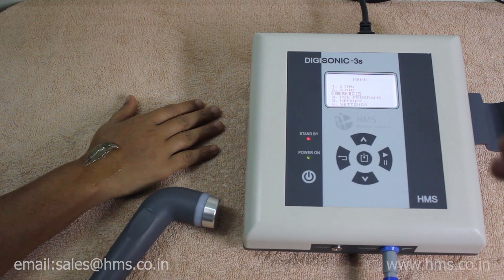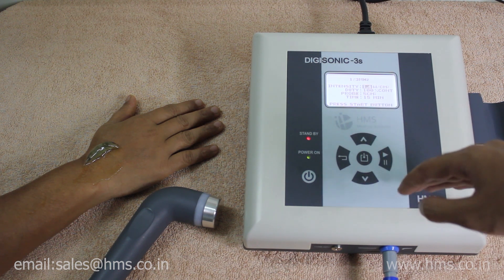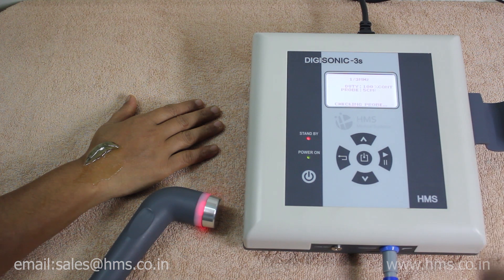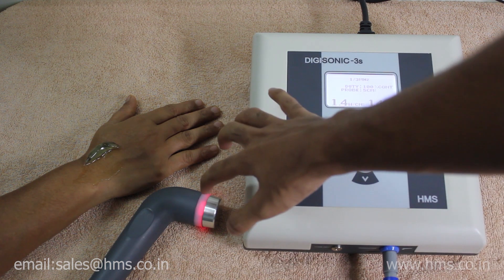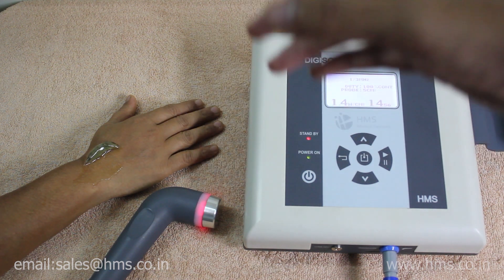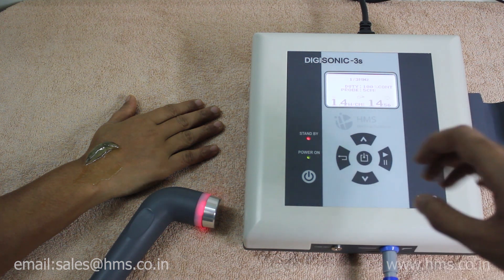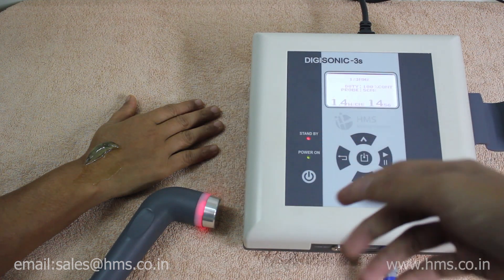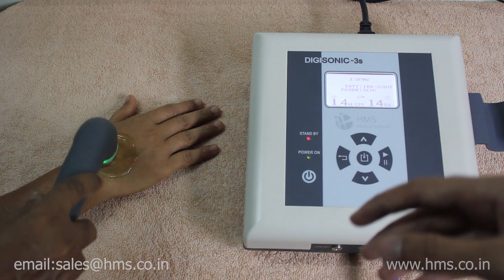Now we'll demonstrate the 1+3 MHz frequency mode. Select it, set the intensity level, and set the duty cycle to 100%. Press start to begin. Before the transducer makes contact with the skin, the transducer light glows red. Once the transducer is placed on the skin, the light turns green, indicating treatment has started.